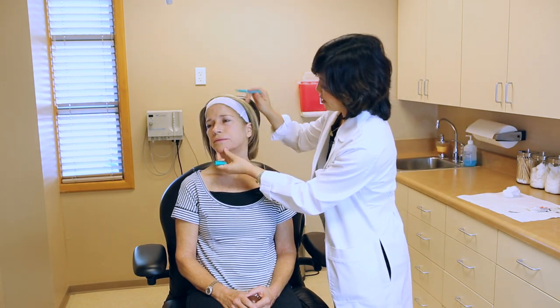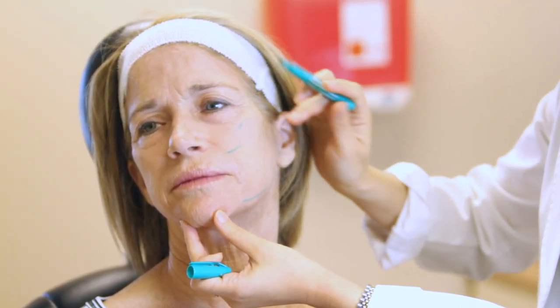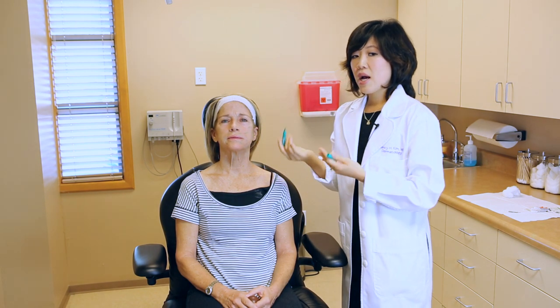Then we laser away the layers of the skin. For her, I think her problem areas — if we turn her head like so — you can see the texture of the skin, there's quite a bit of solar damage, wrinkling, and it's really around the mouth here. Something really important I tell all my patients is that you can get filler around the mouth to help erase these lines, but there's only so much filler you can put in without looking unnatural. I'm sure you've seen people who've had tremendous amounts of filler put around their mouth and they get kind of a duck lip.